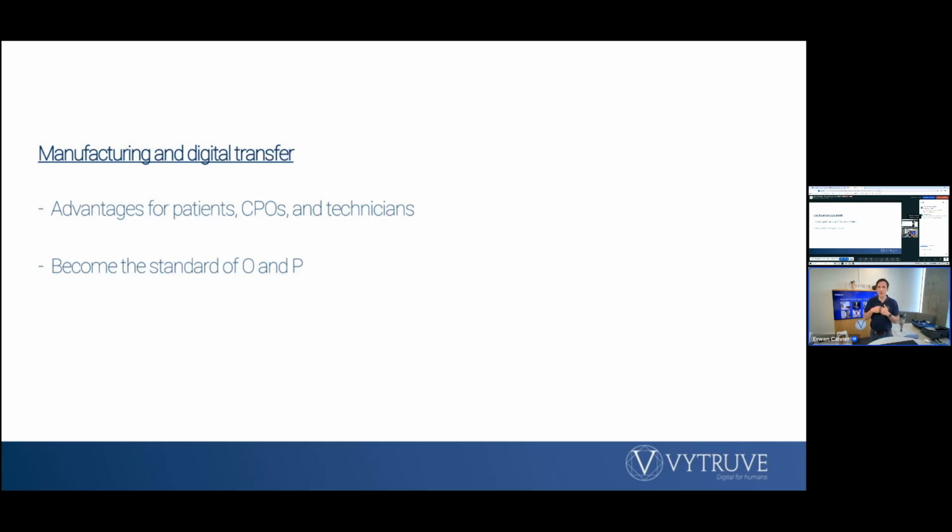So I have an orthopedics company. I have used all this process for 3 months now, and now it's really the new standard. And I'm sure in 6 months or 1 year, all patients will keep the check socket during the definitive socket, and it will be the standard to use 3D printing, to use manufacturing mixed with digital, and I'm sure everything will be very, very great for patients, CPOs, and also technicians.